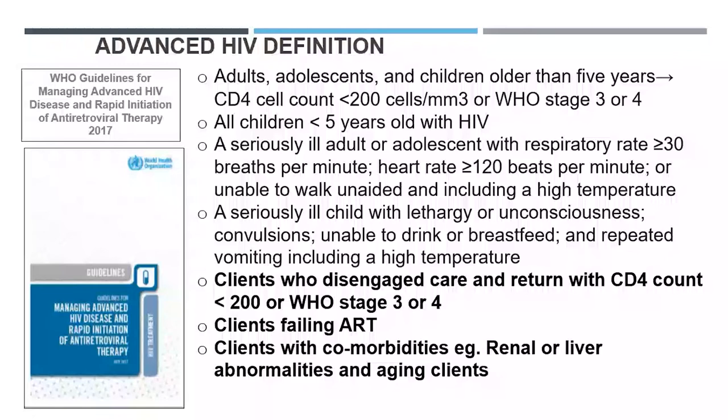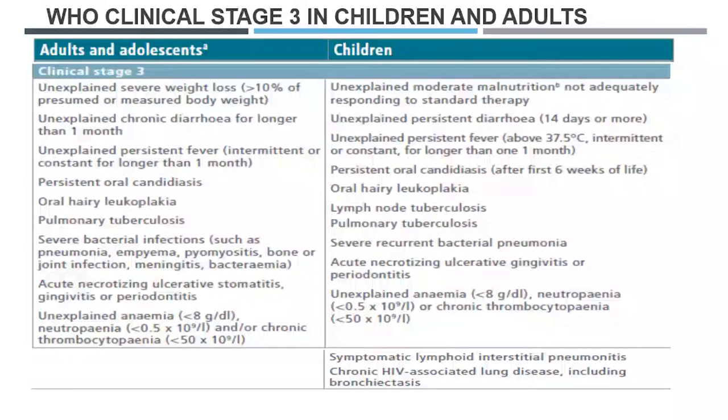So within that same Cochrane review, they had looked at three different studies. One was in Tanzania in the OPD setting, children 6 to 14 weeks. There was another study, I think, within South Africa, which was in an OPD and an inpatient setting in children under 15 years of age. And the third was in hospitalized children under 12 years of age. Looking at the use of LAM in being able to diagnose TB within this patient cohort.